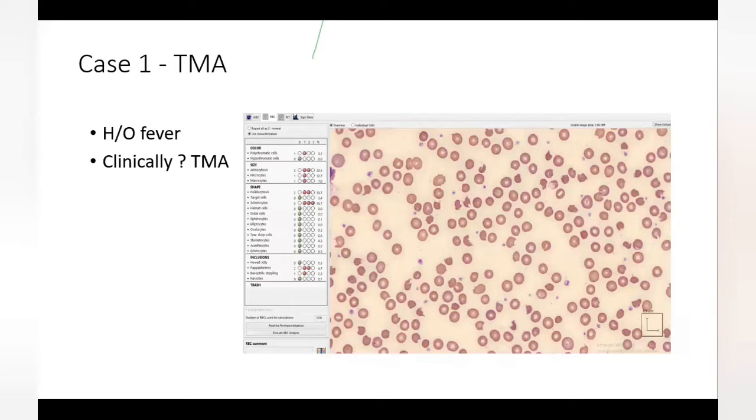And I think pathologists are largely responsible in making sure that that doesn't happen. And this is one place where quantifying and doing a differential count for RBCs, which we don't do in common practice because it's practically impossible, becomes useful. I think we'd go mad if we started actually doing a differential count on RBCs. But just look at this particular slide.